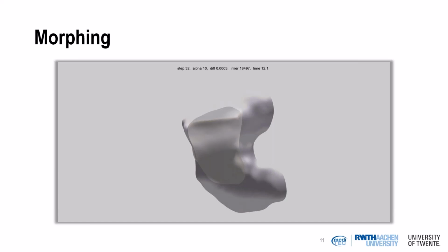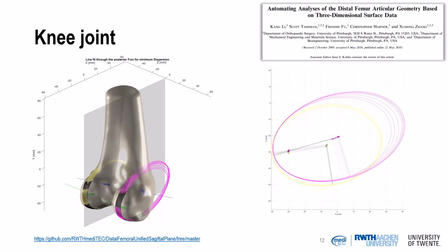One thing I would like to mention here, which is not shown, is that of course this only works when we have surface models available. Very often in the clinical routine, for example, the fibula is not segmented and provided, as this is not really needed for the implant planning itself. So here we used an overall affine transformation to estimate the attachments of the lateral collateral ligament, which attaches at the fibula head.